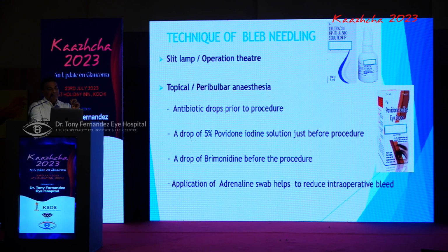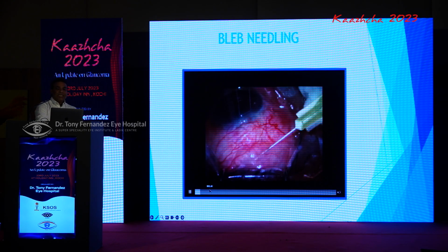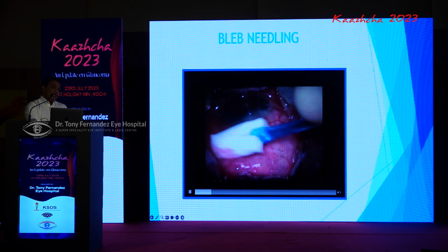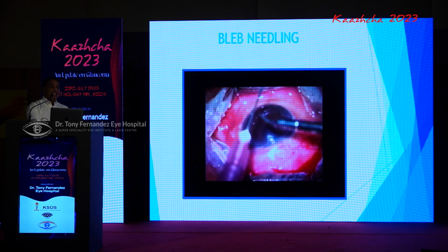You can apply the brimonidine drop before the bleb needling, so it will constrict the blood vessels. So coming to the cases, I'm showing a few cases of how to do it. So this is me injecting the mitomycin C after taking aseptic precautions, and keep your mitomycin C as posteriorly as you can.